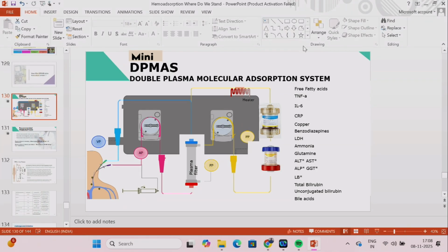Aniket? Sir, how frequently do you suggest the use of this HA130? Can we offer it to the patient once a month? No. See, this is a Shanghai protocol, but we customized it. So first 2 weeks we do twice a week. Next 2 weeks once a week. Then every fortnight. And that has to be continued for at least 12 weeks.